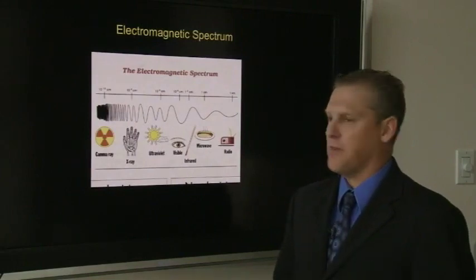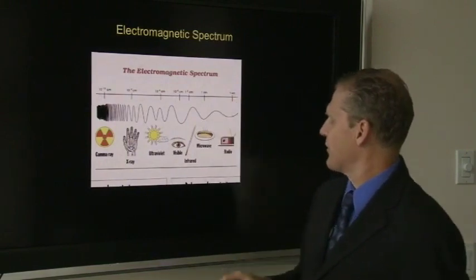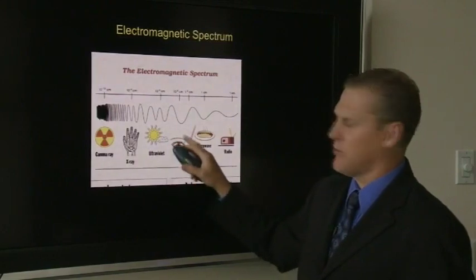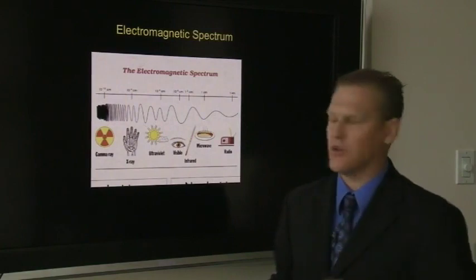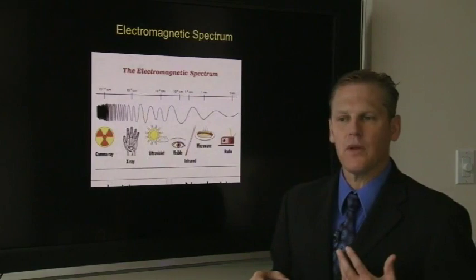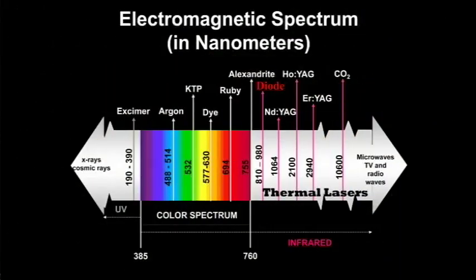We call the electromagnetic spectrum the spectrum that occurs from very short wavelengths to very long wavelengths. Radio waves, microwaves are typically longer wavelengths. The visible region of light, which is the reds and the blues and the purples, the colors we see in the rainbow, occur in this area. And those visible regions are really between 400 and 700, around there, nanometers. And 488 is blue. It is argon, for instance, the old argon. 514 is green. 600s are red.